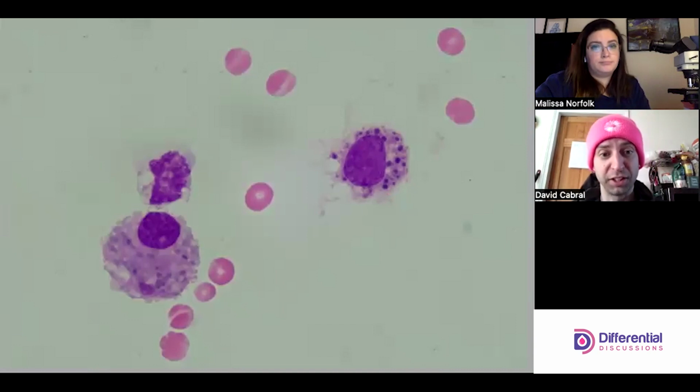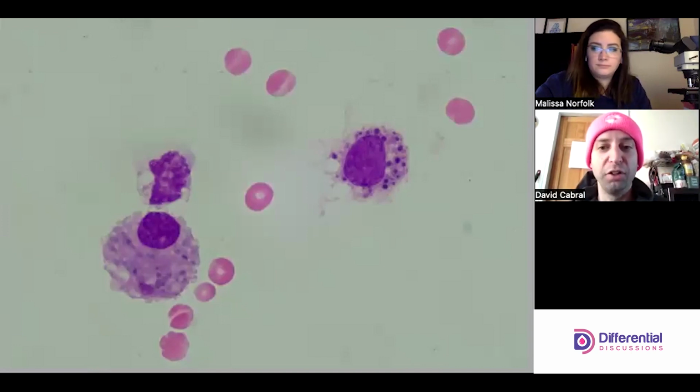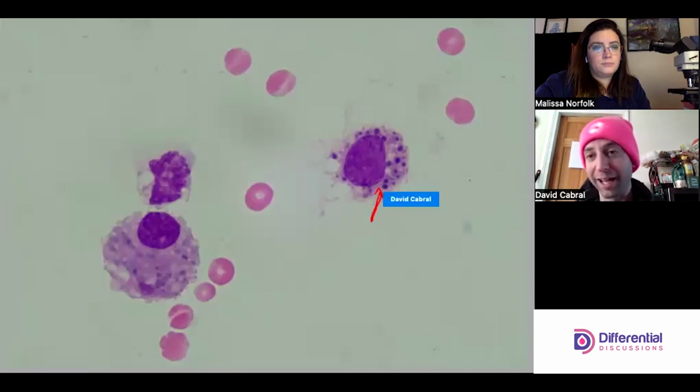So we had erythrophagocytosis, and then its constituent pieces will be broken down. Hemoglobin; there's pretty much not much else in red cells. And so you get these siderotic kind of granules, right? This iron stains bluish, blackish, depending on the concentration. So I think that's probably the most likely explanation for those inclusions. Agreed.